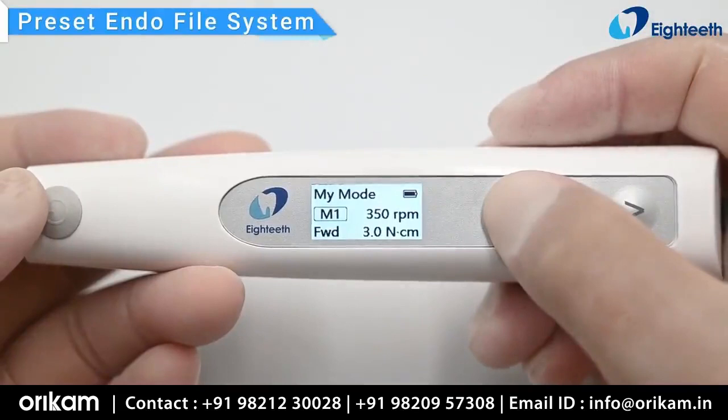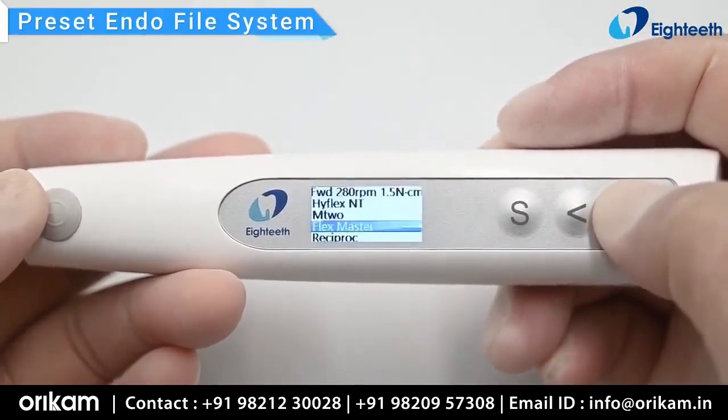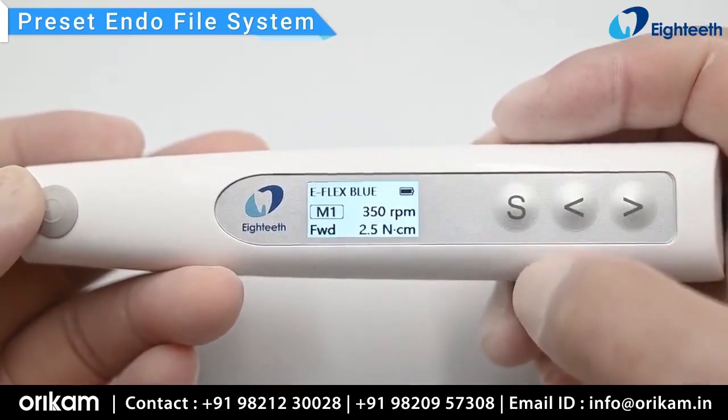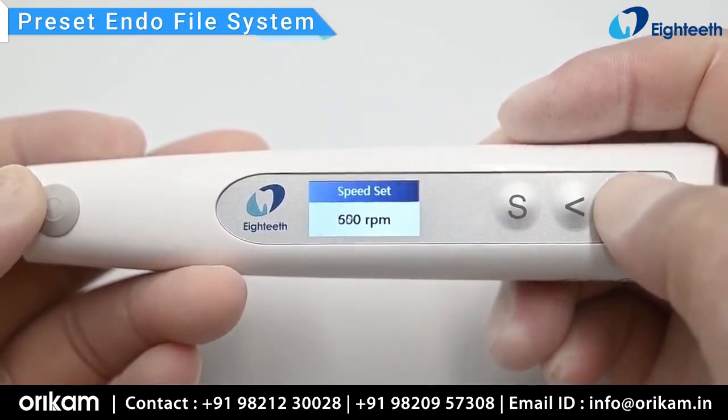In M1 through M10, long press the setting button to select the endo file system. The device will automatically set the rotation speed and torque recommended by the manufacturer. You can also manually change the speed and torque.